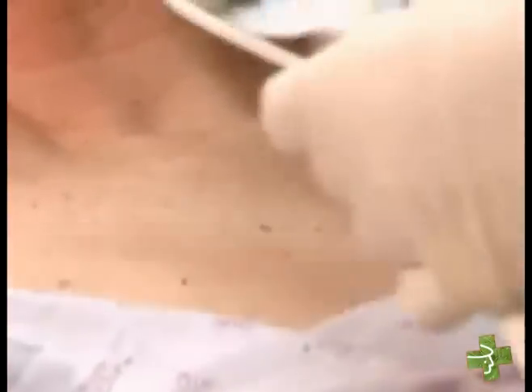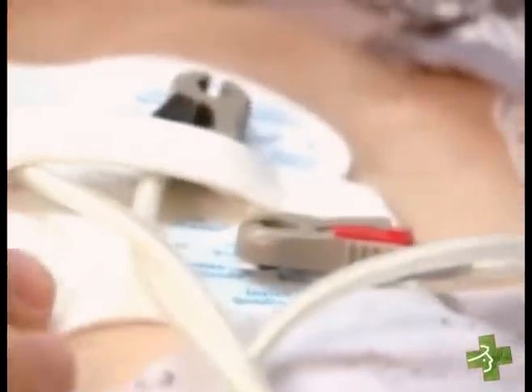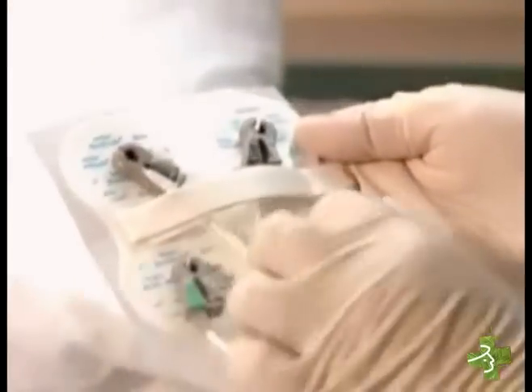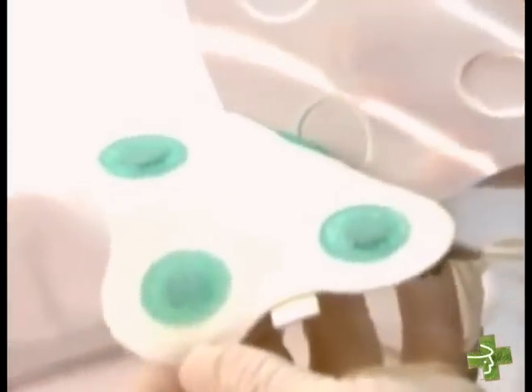Be sure that there's complete contact between the electrode surface and the patient's skin. If the contact is poor — for example, if excess hair hasn't been removed or if there's an air gap between the electrode and the skin — a serious burn can occur even if you are using electrodes and cables that are approved for MRI. Inadequate contact can also occur if the gel layer on the electrode has dried out, so avoid using electrodes that are past their expiration date and inspect each electrode before using it.